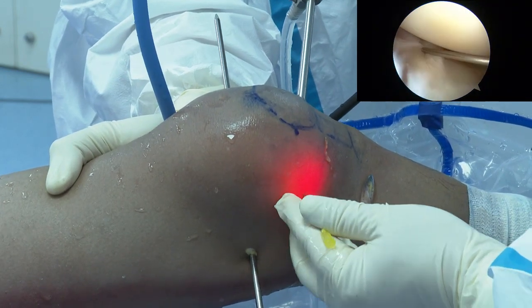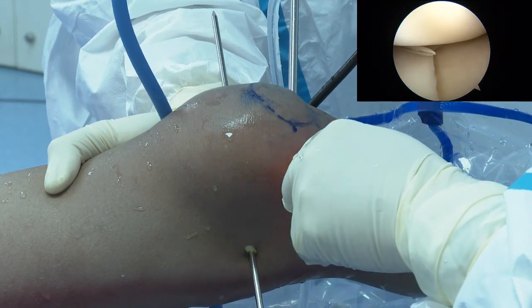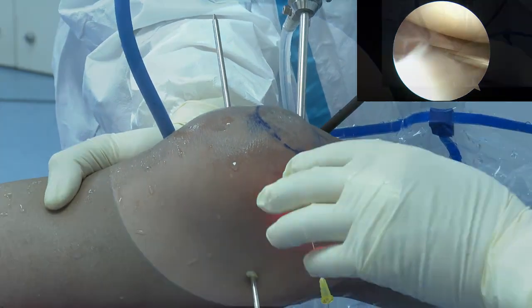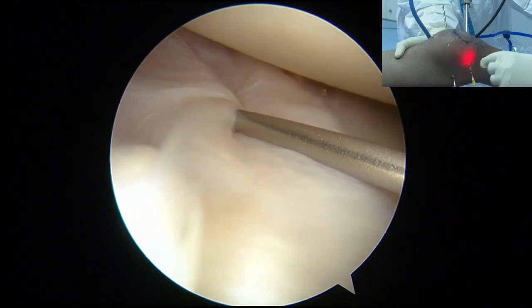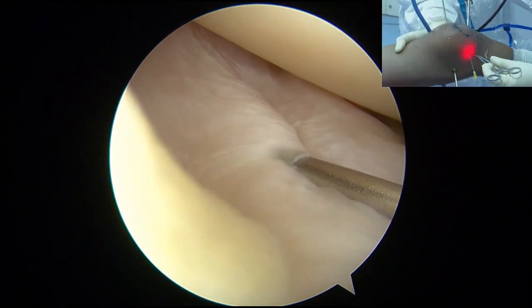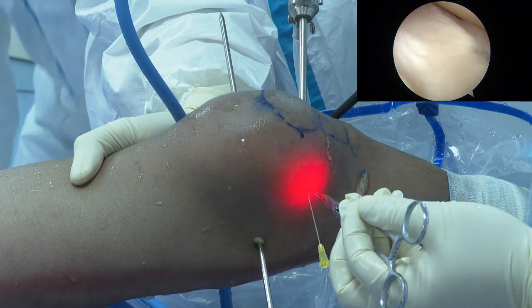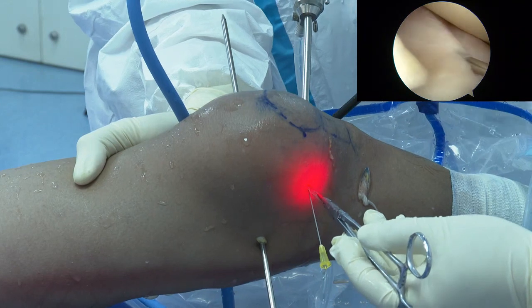就在半月板上缘穿进去。Okay. So from here, you can work very well because you are getting close to the meniscus, right? If you're working from the front, it's too far. Okay? Give me the knife. Okay. So here we call this the mid-medial portal. Turn your knife up. Keep it. Okay. Above the needles. Okay, like that way.